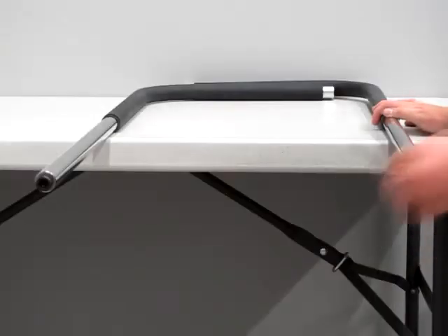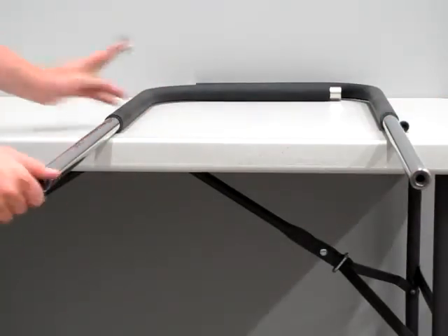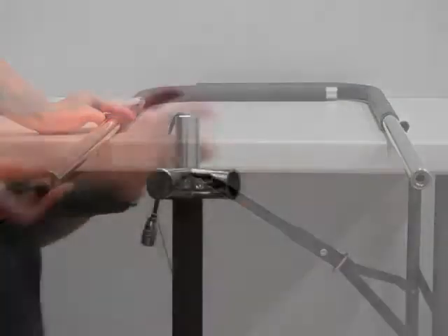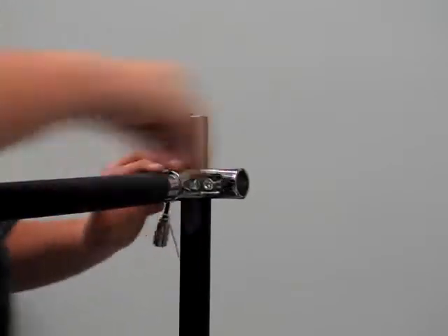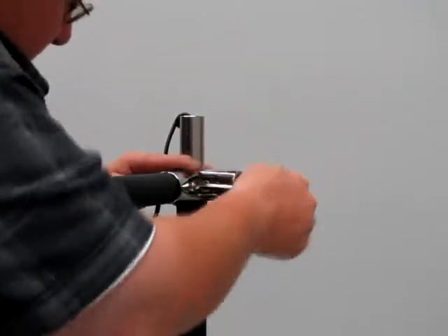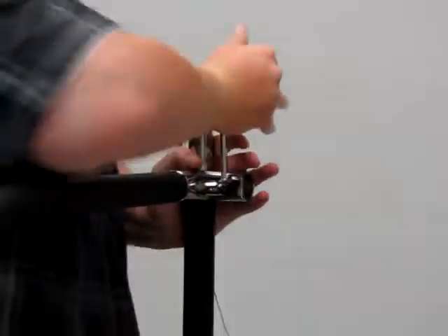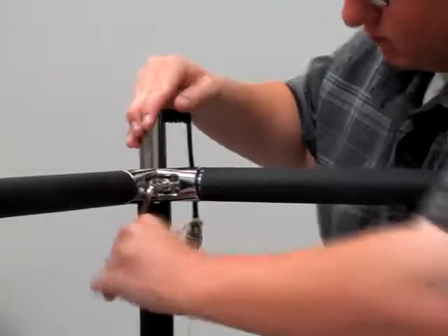Before installing the handrails, the bolts located at the bottom of the handrails need to be taken out. Once this is done, the handrails need to be inserted into their holders on the column. Do this by loosening the holder screws on the column and inserting the handrail into the holder, after it's been placed into the correct socket on the platform. Then tighten down the holder screws to set the handrails in place. Do this for both rails.